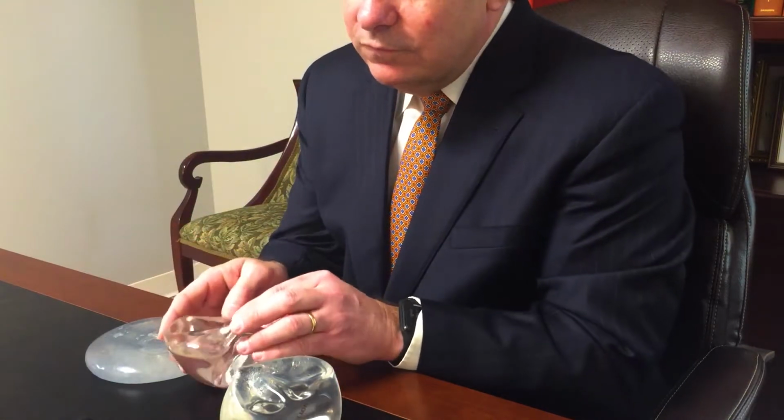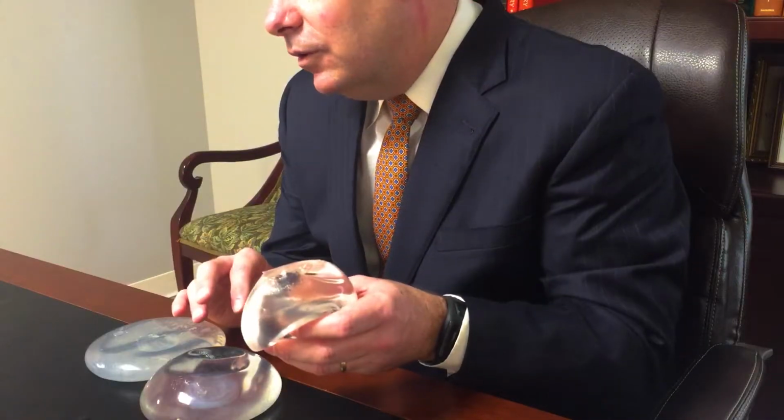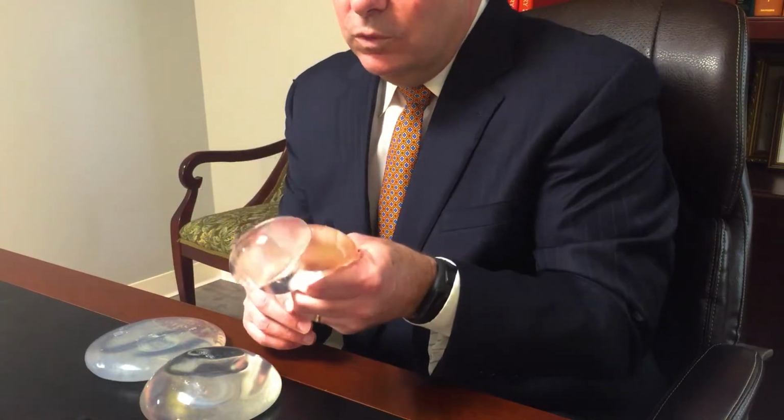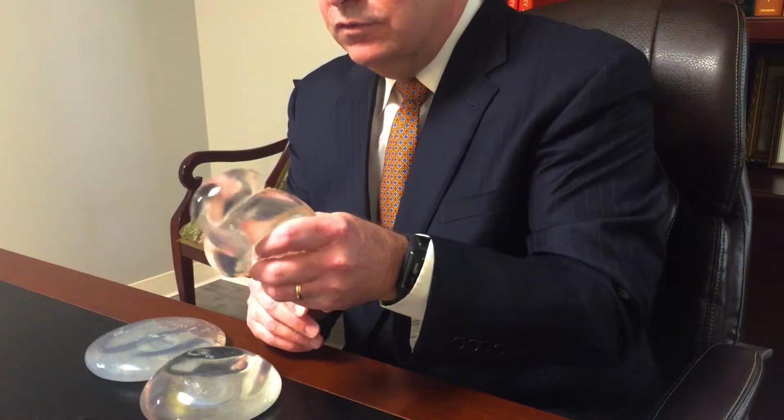And also, whether it's a saline or a silicone implant, the shell is made out of silicone. If the shell of a silicone implant were to get a hole in it, this jelly-like substance can squirt out, but as the pressure is let off, basically that silicone jelly retracts back into the implant. So it doesn't tend to deflate like a saline implant would once it gets a hole in it.